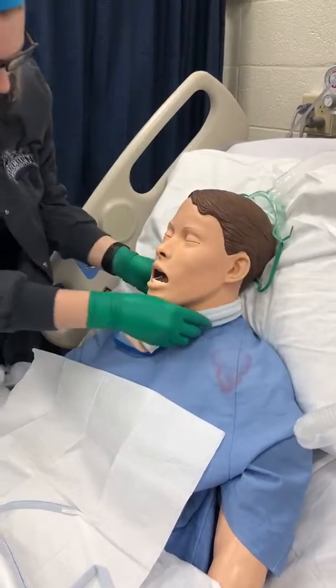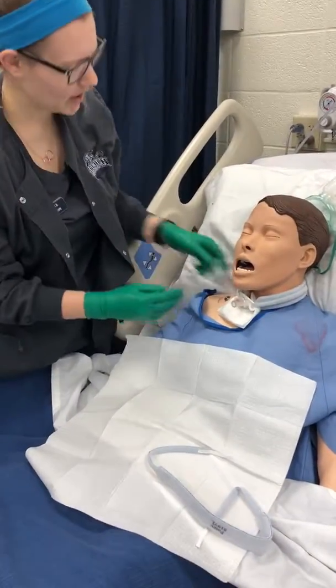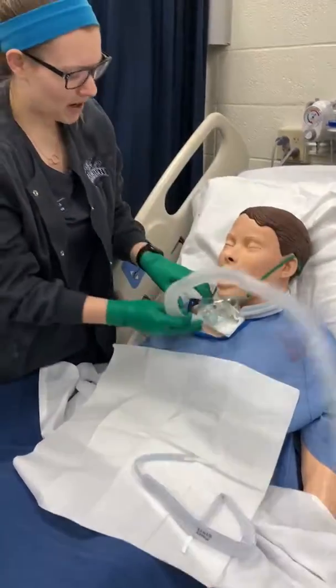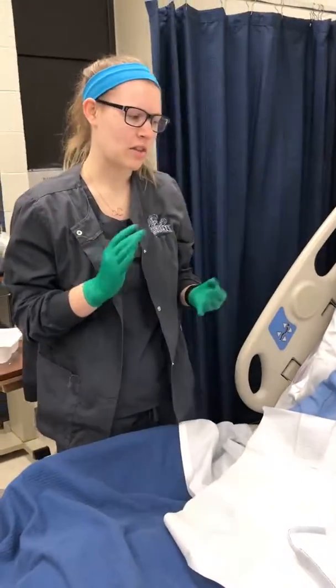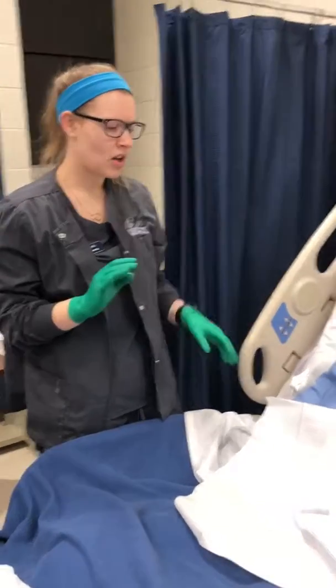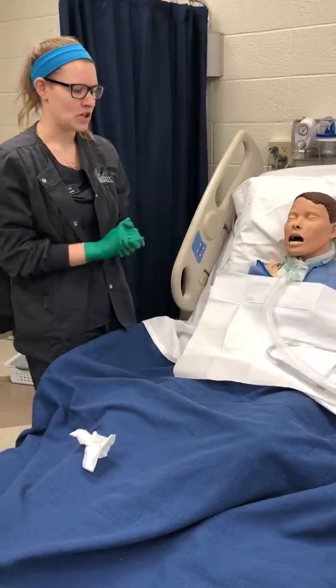And then adjust it as you need to, and just make sure that you can get 2 fingers in here so that you know it's not too tight. And then put the oxygen back on, and make sure you document everything you did. Document the secretions, how much you suctioned out, the color of the mucus or the secretions, and how the patient tolerated it.